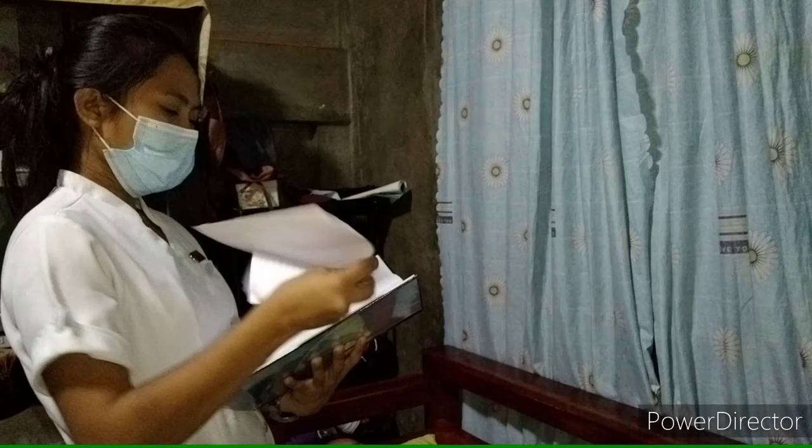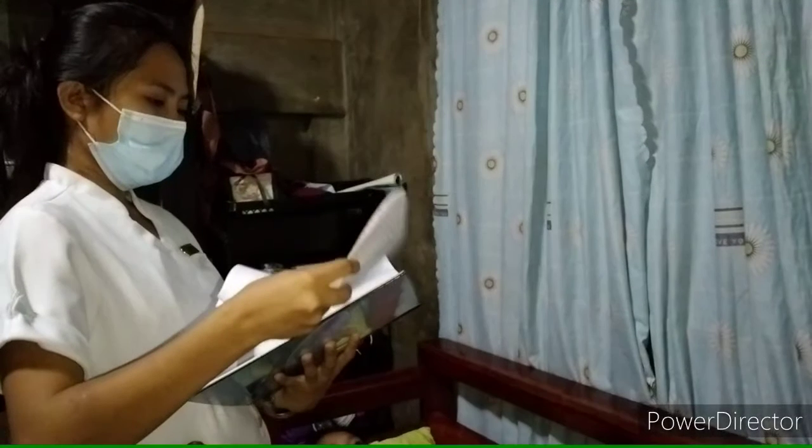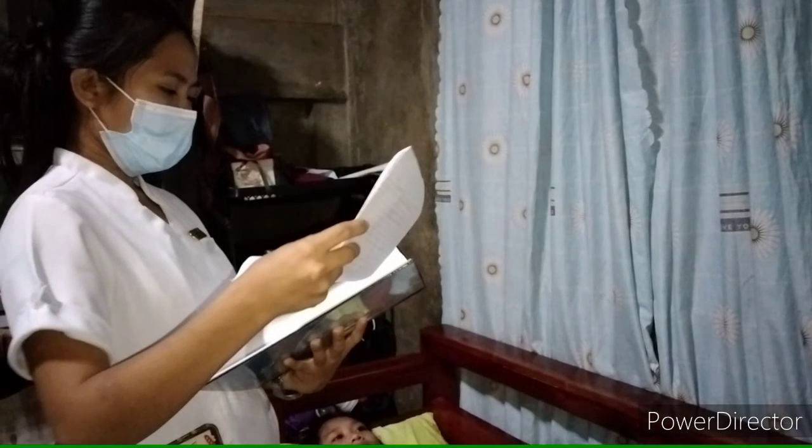Let's verify the physician's order for formula, rate, route, and frequency. Laboratory data and bedside assessments, such as finger stick blood glucose measurement, are also ordered by the physician. Rationale: tube feedings, laboratory tests, and bedside tests must be ordered by the physician.